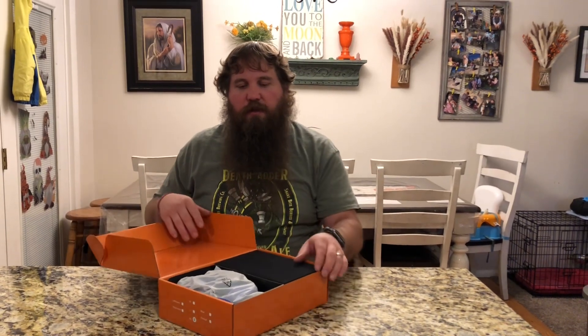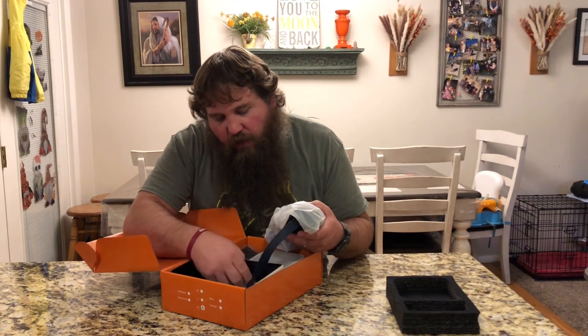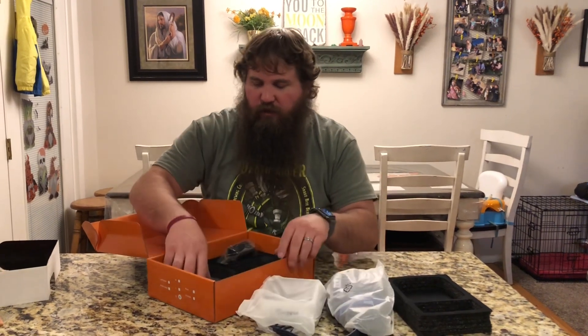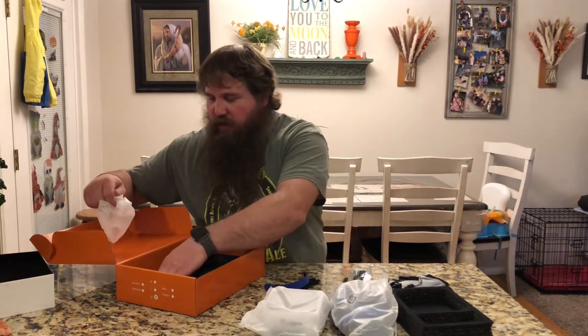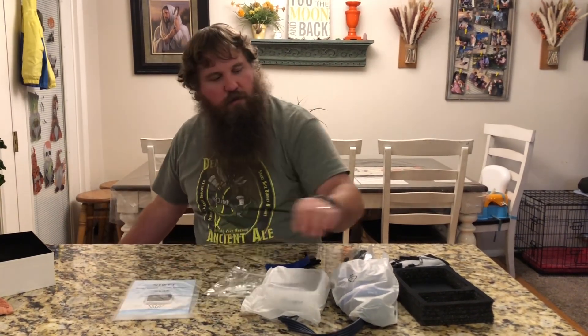I have here a rehabilitation robot glove. I'm going to open up this box and take it out. We're gonna see how this works, show all the features and some of the key points. It looks like we've got the glove and the controlling unit, a power cord, an extra glove or inner sleeve, some straps, the USB cord, and instructions.